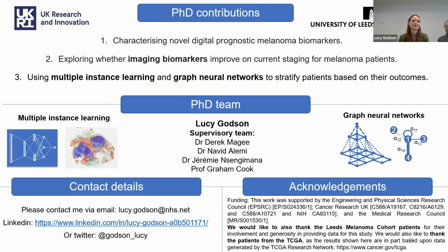I just wanted to touch on, you had two data sets, right? So did you try training on one and testing on the other for the survival analysis as well, didn't you? I haven't tried that yet, no. We have the TCGA data set, which does have primary cases. So we trained the survival model just using primary melanomas, and the TCGA does have some primary cases. So I think that's the first thing to test.